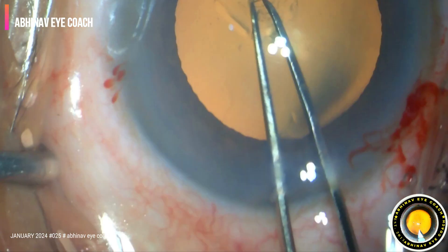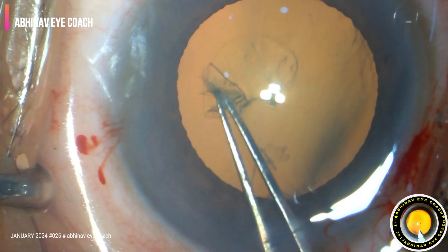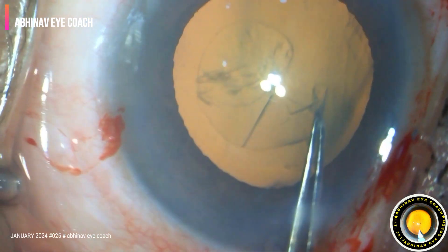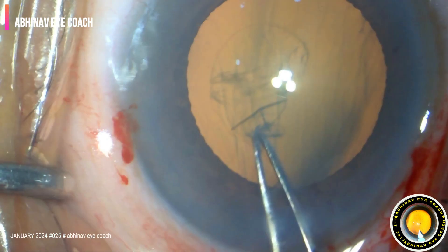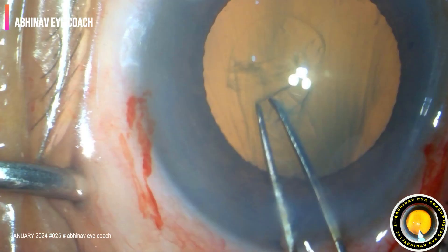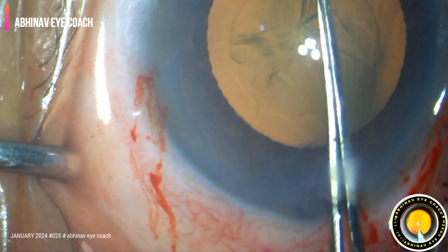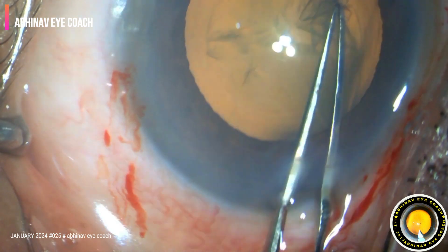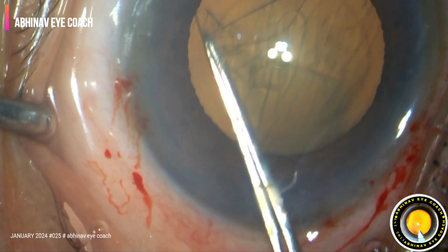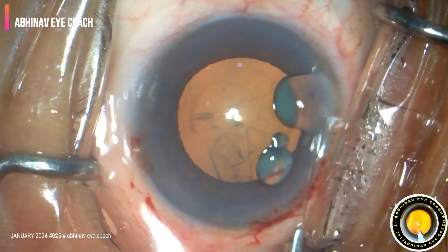A nice adequate size rhexis. You can see the marking on the forceps — this will give you an idea to get an adequate size 5 to 5.5 mm diameter rhexis. Gently this flap is raised and the rhexis is made. The patient is a bit uncooperative, trying to move his eyes throughout the surgery, but the rhexis is made. Perfect round circular rhexis is achieved.